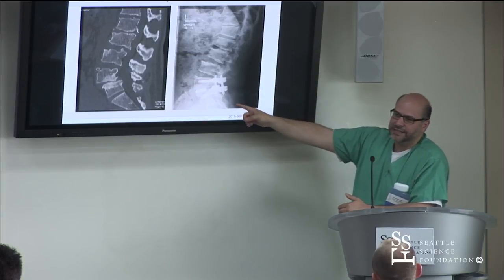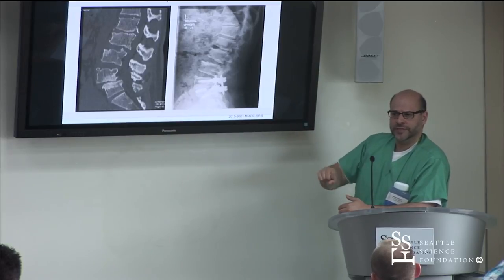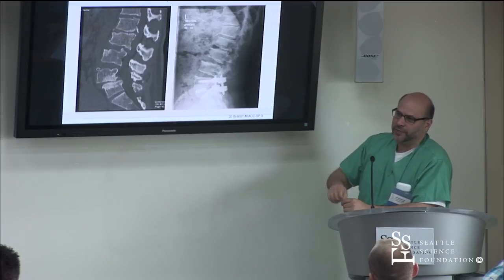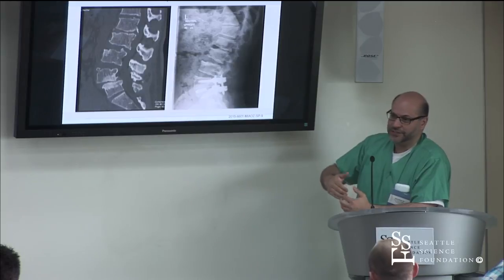When they're collapsed like this, even though she's got the Modic changes and it looks strong, I'll just start with the blunts and get an idea, okay, how mobile is this thing before I start cutting into the endplate. If it's really mobile, I'll just do a couple blunts and then I'll go straight to shaving. If it's not mobile, then I'll take my time with the blunts and really try to loosen things.